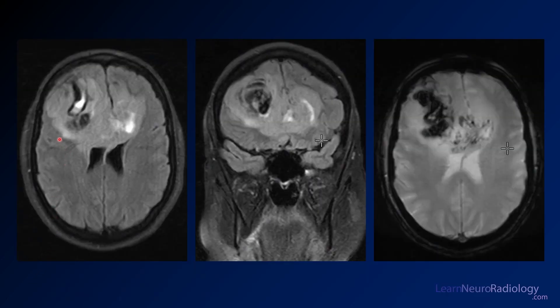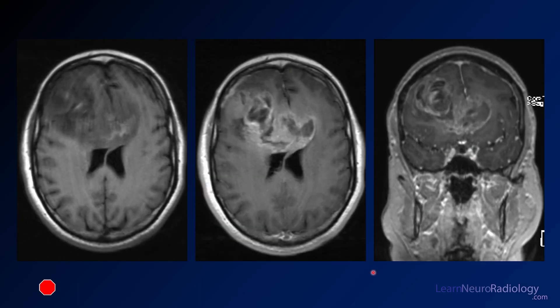Here's the MRI on this patient. On axial FLAIR, you see areas of siderosis — low signal from iron in blood products — with internal high intensity also from blood products. On coronal FLAIR, you just see those blood products and tons of mass effect. On blood-sensitive GRE imaging, you see blood products even in areas that didn't look so bad on CT — definitely a lot of hemorrhage within this mass. On pre- and post-contrast, you see areas of intrinsic hyperintensity from blood products and a lot of heterogeneous enhancement. This is a really ugly-looking mass with areas of necrosis and non-enhancement, ill-defined infiltrating margins.